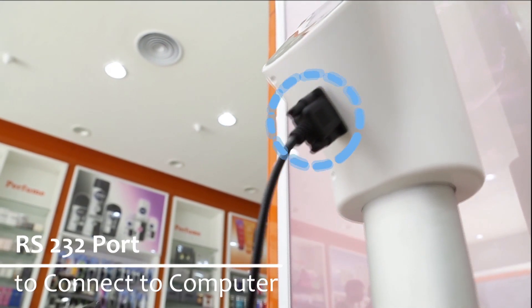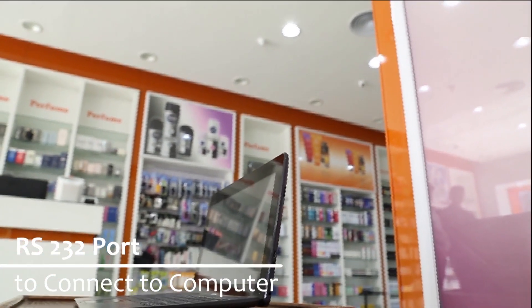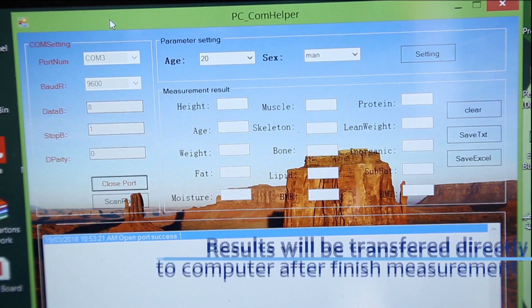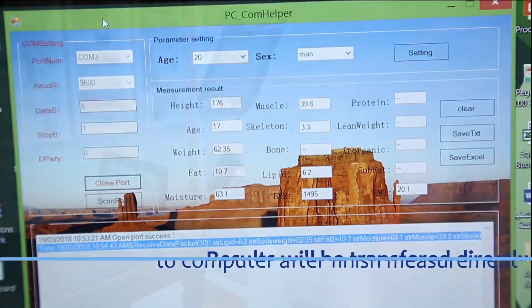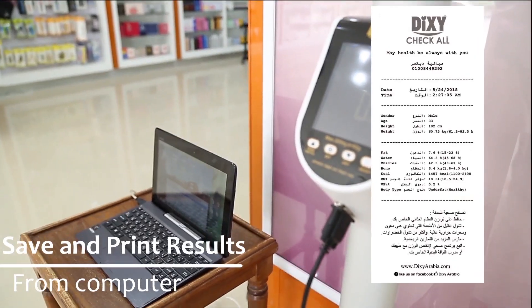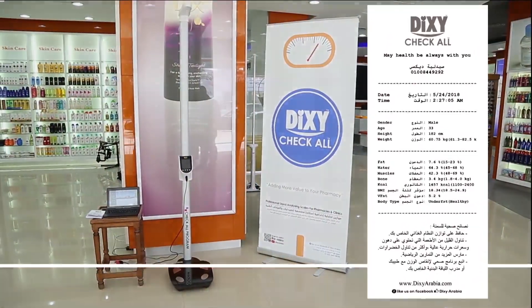Dixie Check-All BYH-03 has an RS-232 port so it can connect with a computer to transfer results. Results will be displayed directly on the computer once you finish the measurement and results are displayed on the scale. You can save and print the results from the computer directly after that. This is a very important option in the BYH-03 scale.